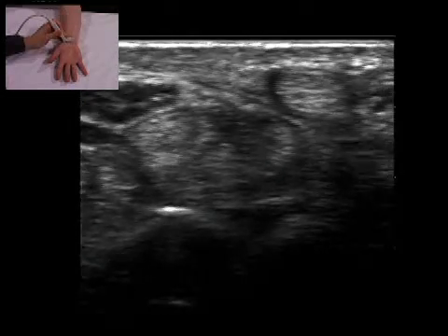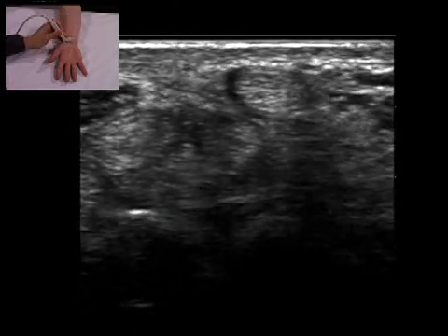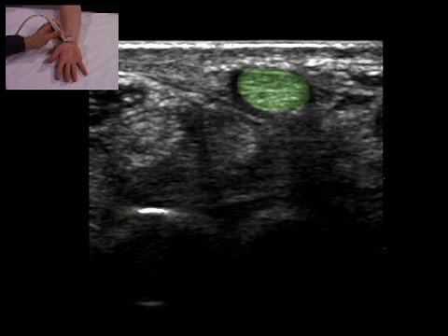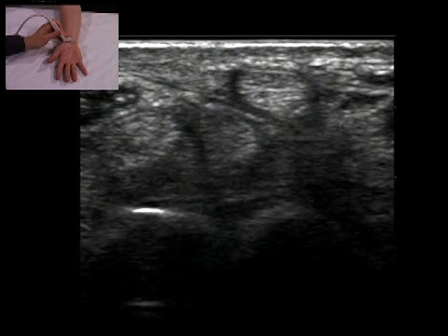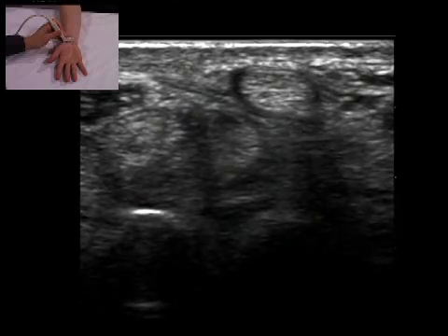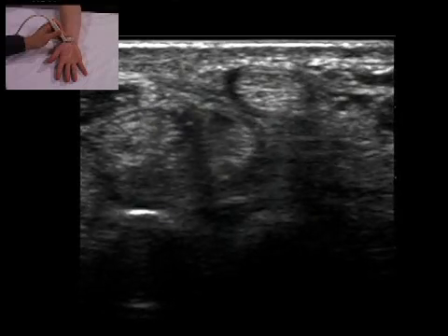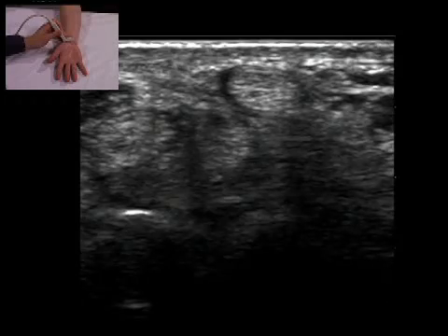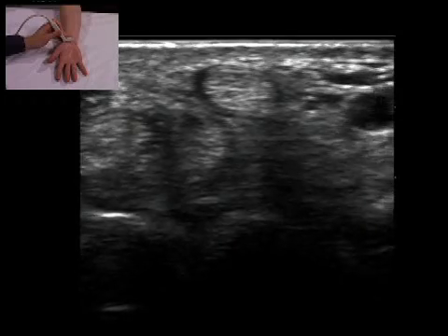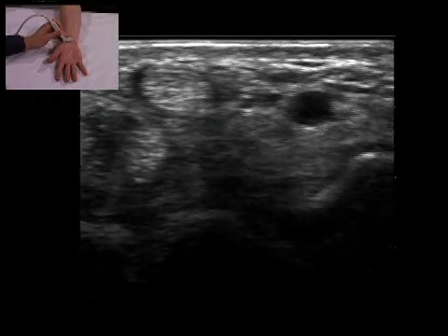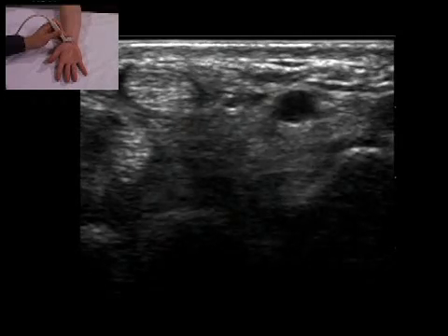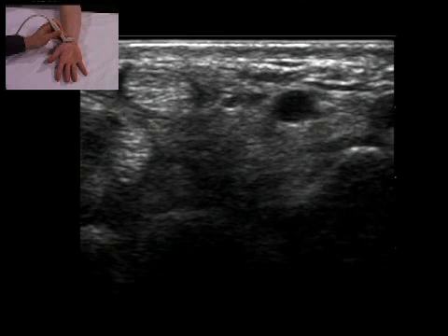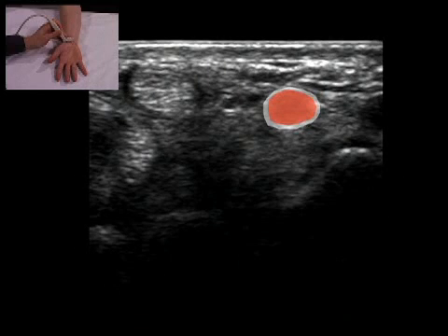The probe is moved to the radial side, where flexor carpi radialis and flexor pollicis are identified. Movement of the thumb identifies flexor pollicis longus. Moving radially, the radial artery is observed pulsating.